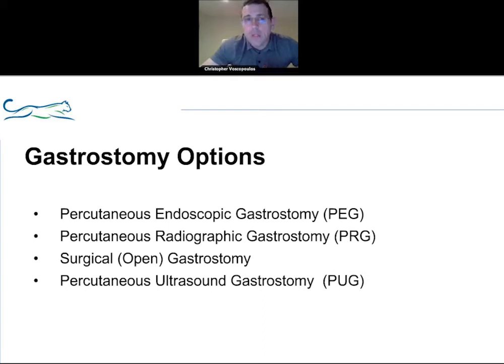to critical care doctors, this procedure will not completely do away with the other techniques. There will still be a point in time where it is more appropriate to do an EGD approach. Say if an individual maybe had concern for evaluation for gastritis or bleeding or other upper GI bleeds. Of course, that individual could benefit from the EGD approach because more diagnosis could take place.